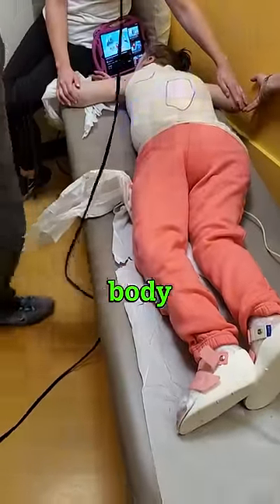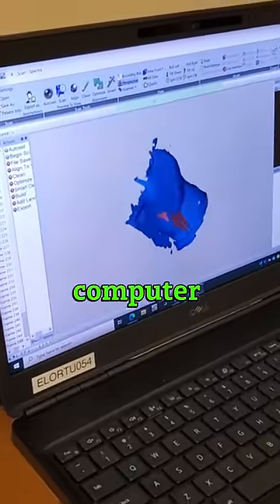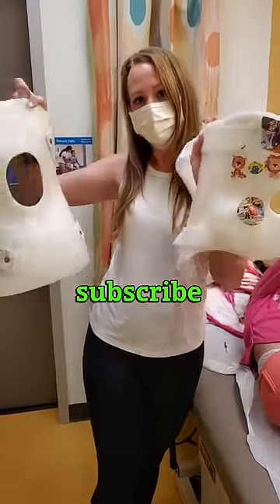He takes pictures of her whole body including the back and front. The pictures are sent to the computer. Now she can get a new tummy brace made.